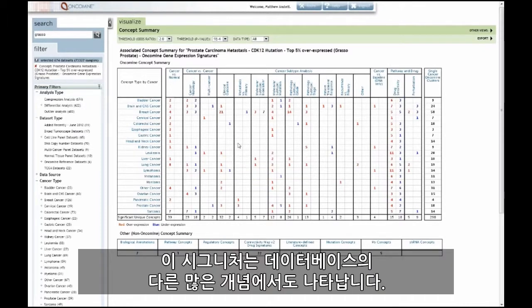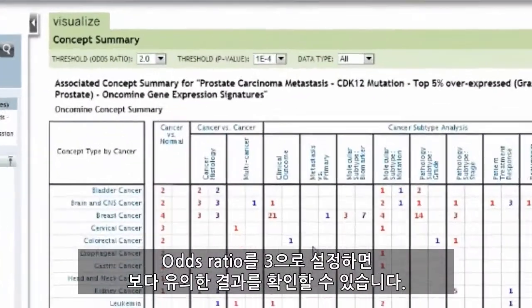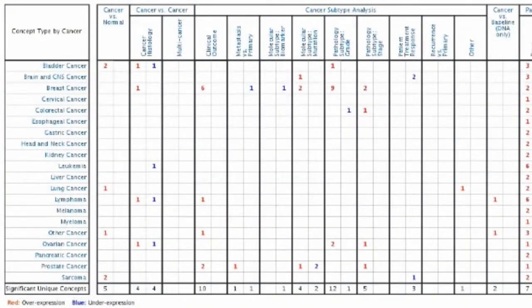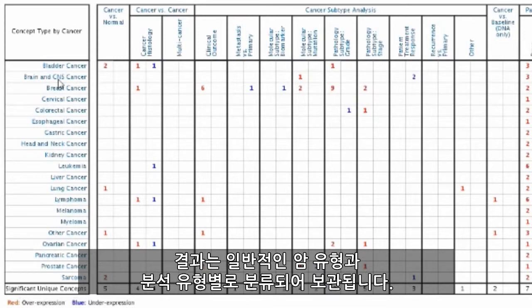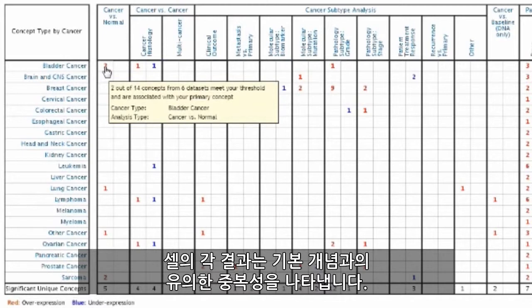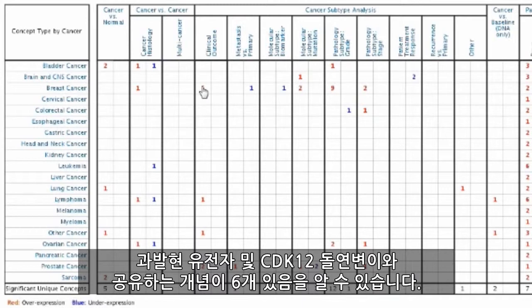We see that this signature appears across many other concepts in the database. By setting our odds ratio to 3, we can view more significant results. Results are classified by general cancer type and analysis type, and each of the results in the cells represents significant overlap with our primary concept. For example, in breast cancer for clinical outcome, we can see that there are 6 concepts that share similar gene sets with our overexpressed genes in CDK12 mutation.